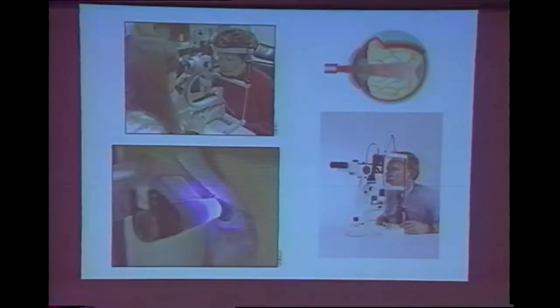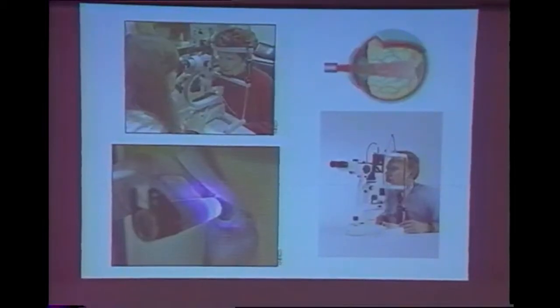In ophthalmology, for retinal disease, this is fairly straightforward for most patients. It's a simple ocular lens, so that the light is just magnified to the particular area in the retina that you want to treat, and this is usually just done through a fundus camera. So this is fairly straightforward, at least as a standalone.